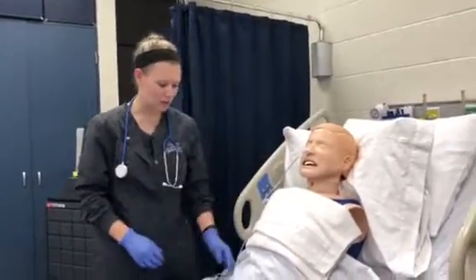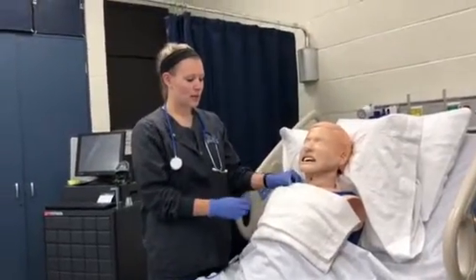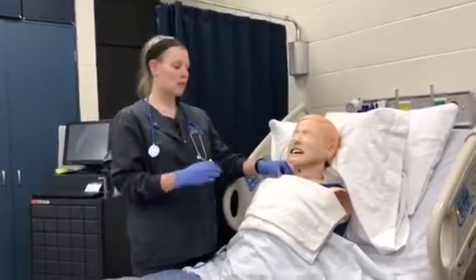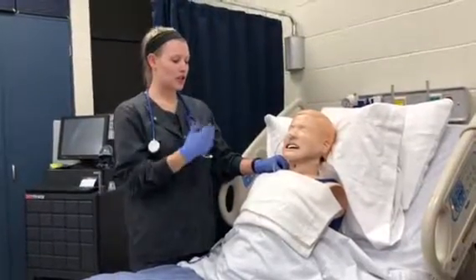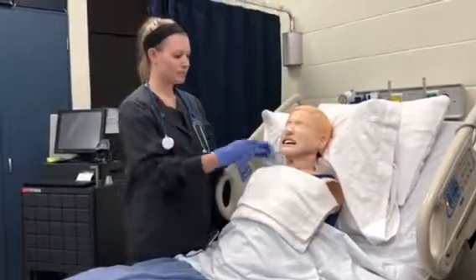This is just a little bit uncomfortable for the patient sometimes. Then you can use tape or a safety pin to attach it to their shirt, and you want to make sure that they can turn their head with it attached to their shirt without pulling on it, so that they have some room.